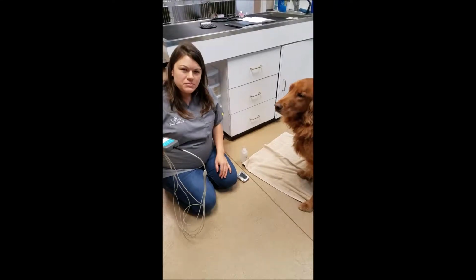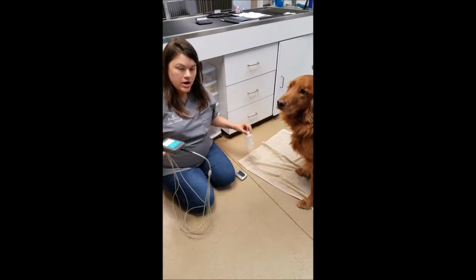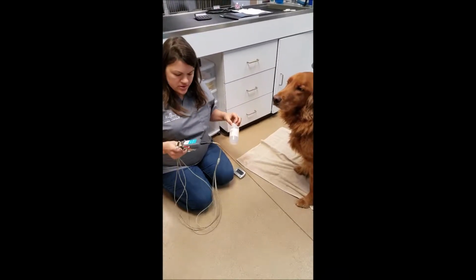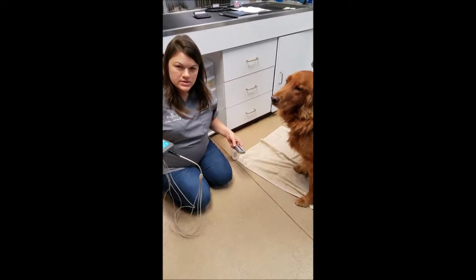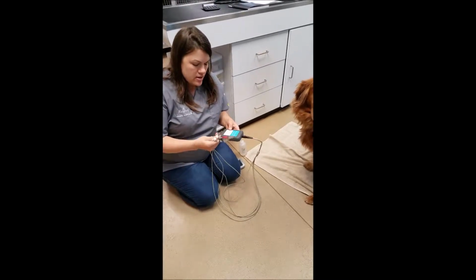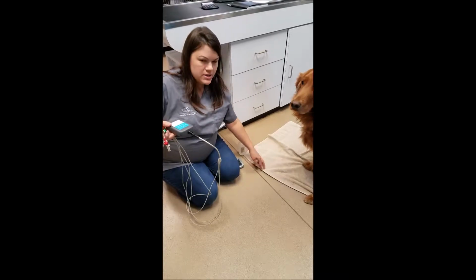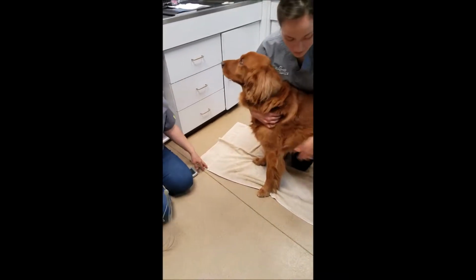Number 17. This is performing ECG on an animal. So I have what I need right here. I have the alcohol for placing on the leads once they're on the patient. I have a timer for timing for 30 seconds, which is what CardioPet needs for their reading. And then I have the ECG device here with the leads, and then I have a towel to place the patient on. So she'll go ahead and lay him down in right lateral recumbency for me.